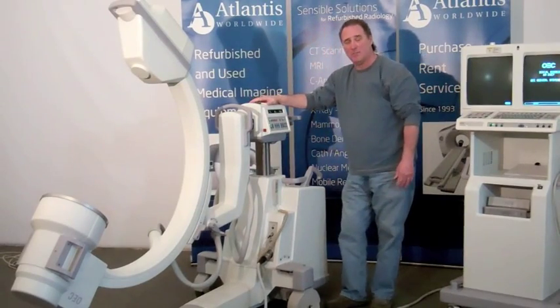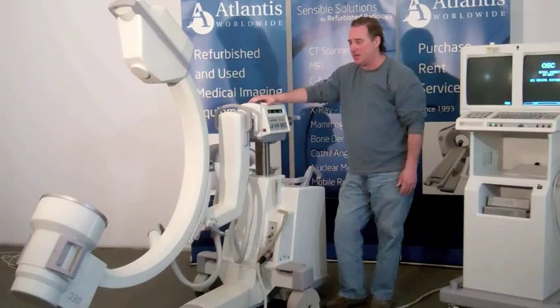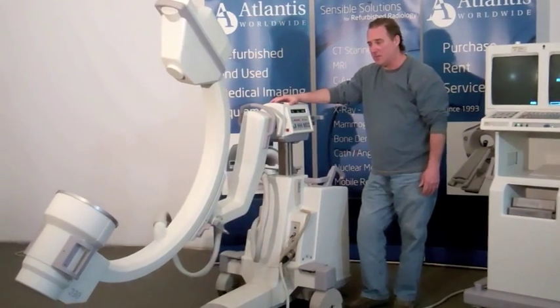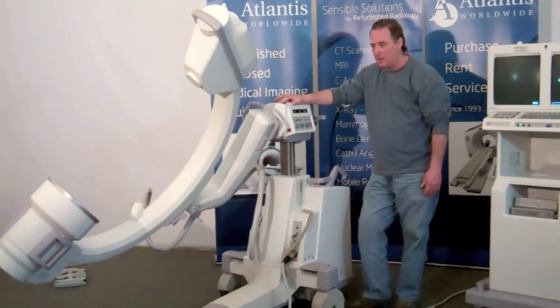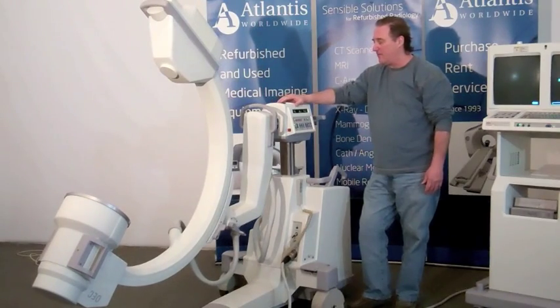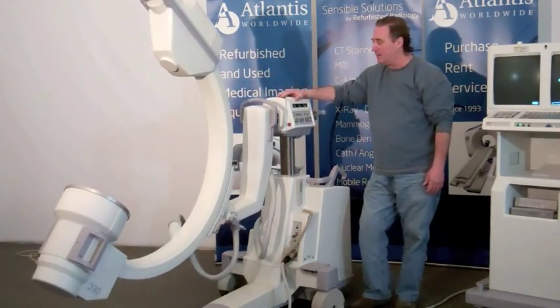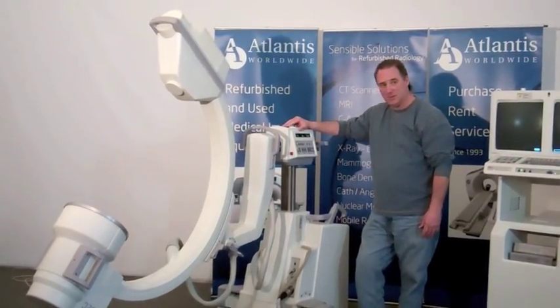It also has motorized portions, such as turning the C-arm, as you see it this way as well as back. You've also got motorized movements up and down.